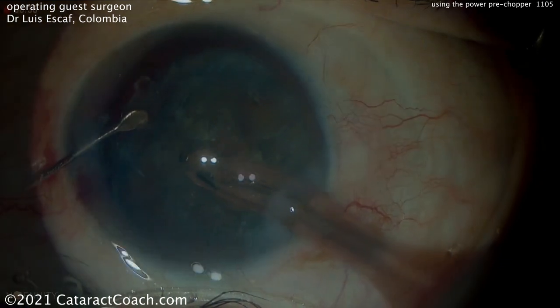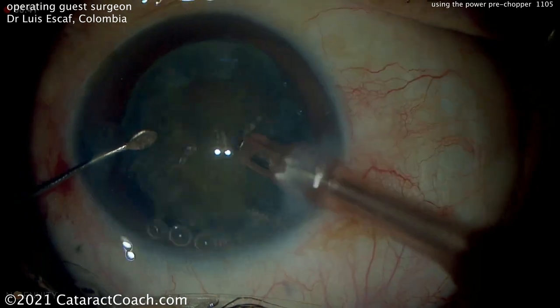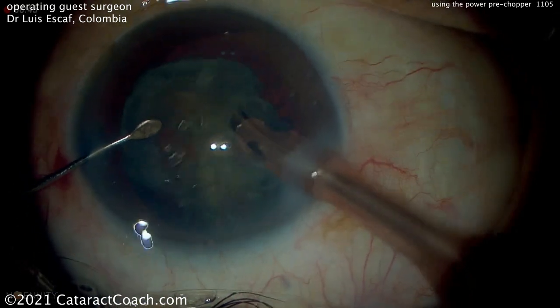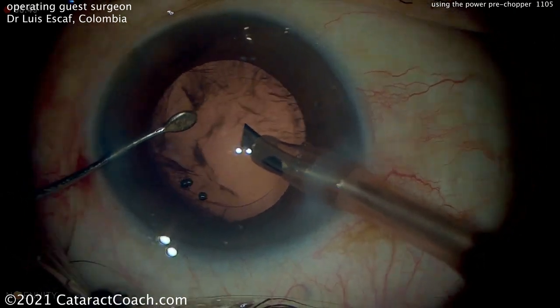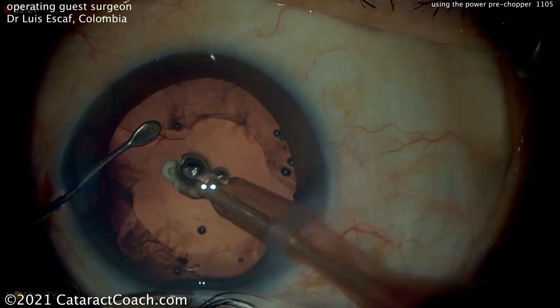Now once you have the four quadrants, time to change out that phaco tip to the regular phaco needle. And there you go — the pieces can then be aspirated very easily. This surgeon here is using a very high flow, similar to what I use. And you can see it make very short work of that lens nucleus.